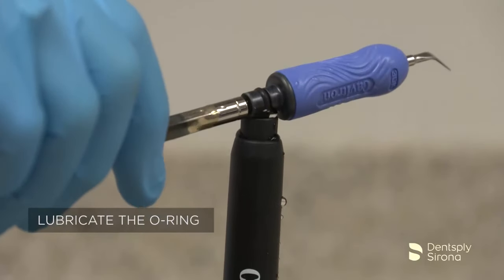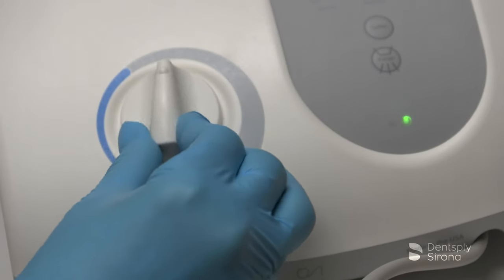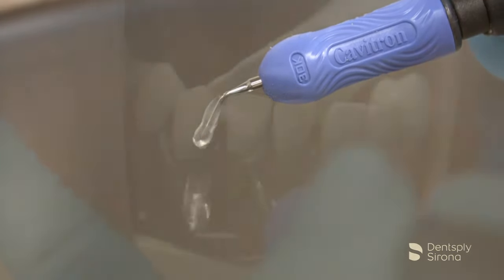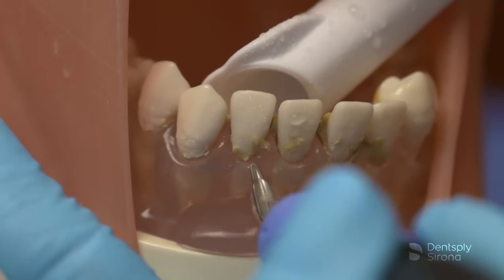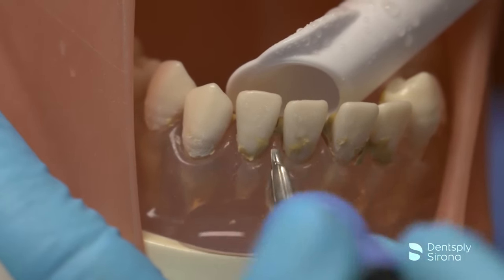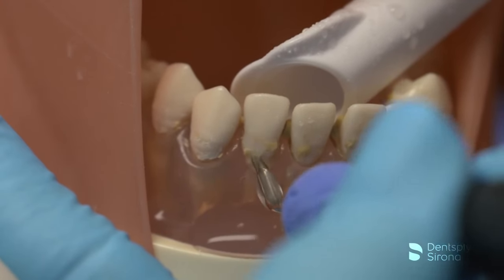After the clinician has filled the handpiece with water, seated the insert, selected the power, and adjusted the spray properly, instrumentation begins according to the treatment plan. The number 3 beaver tail will be demonstrated on the mandibular anterior region, where the insert is utilized for the removal of heavy deposits.